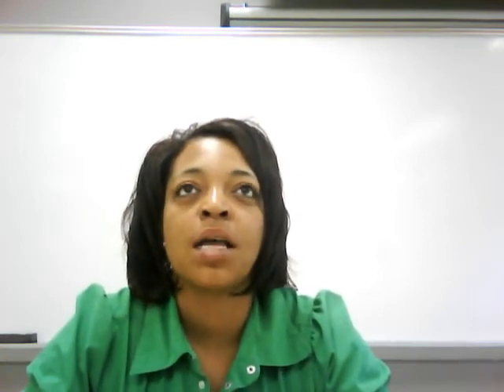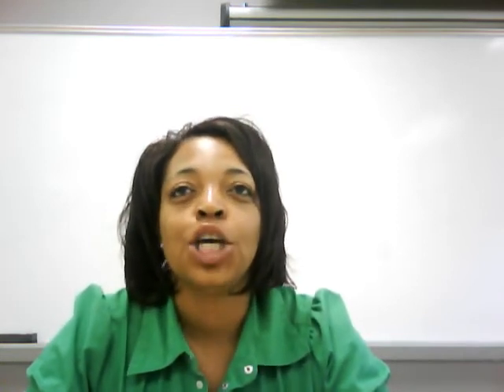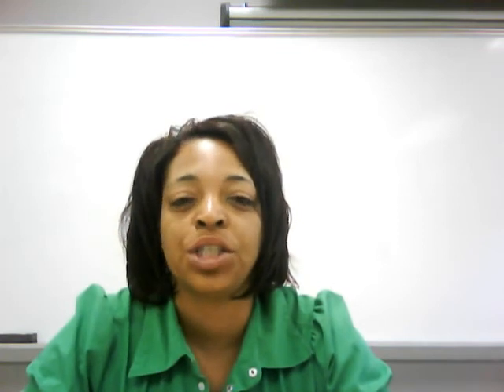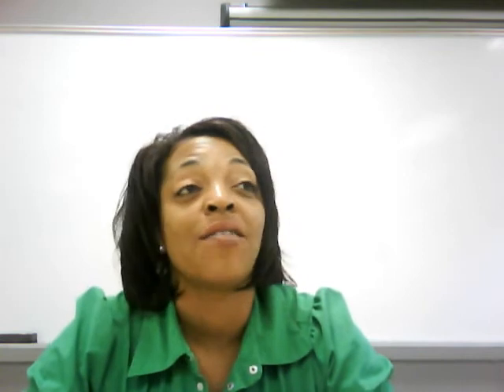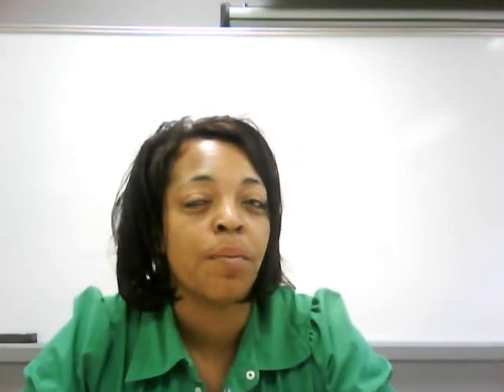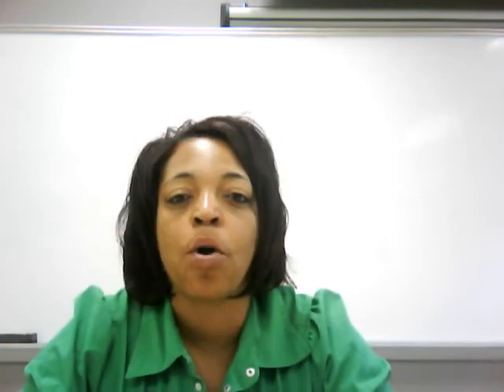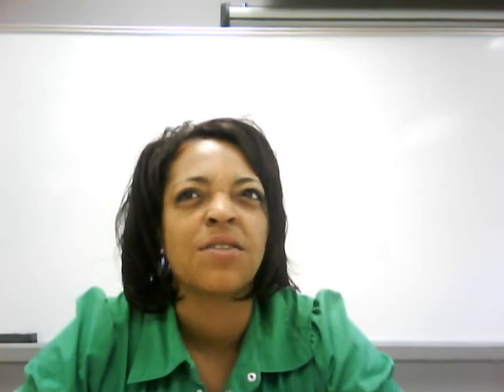And what we want is a lot of darkness to balance out with our lightness to show basically what we're trying to show. And when you have enough darkness in your pictures, that usually shows if you have any kind of disease or any kind of break in your bone. The bone will look white and then it'll have a dark mark across it to where you can see where the bone was broken. And you know, that probably is very painful.